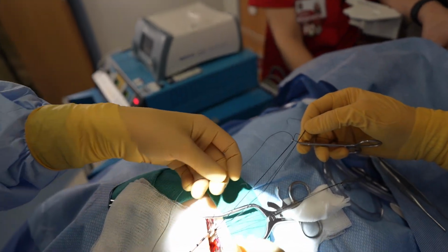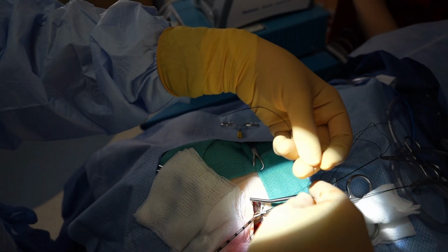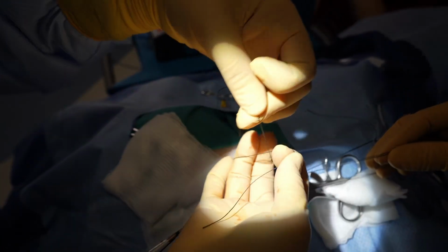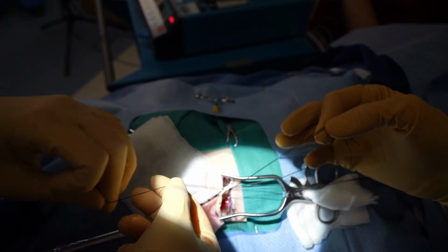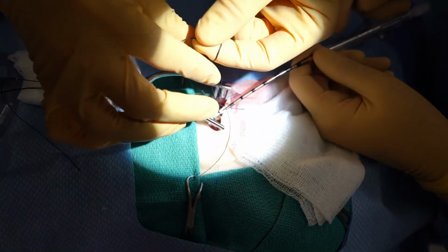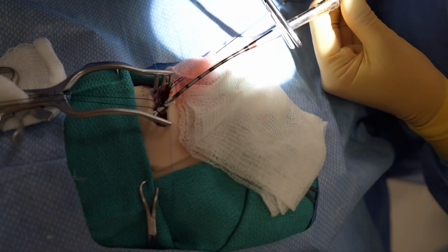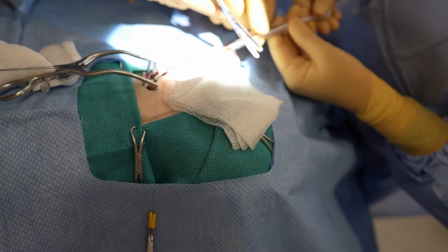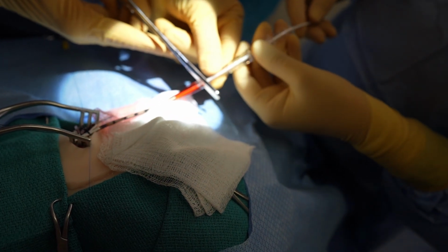Next, we take our cephalic ties and place them around the vessel loop bumper and the cannula as well. Finally, we will tie the cardiac and cephalic ends together in order to secure the cannula in place. Next, we carefully remove the obturator and allow blood to slowly fill up into the cannula. We take care during this portion of the procedure in order to lose as little blood as possible.